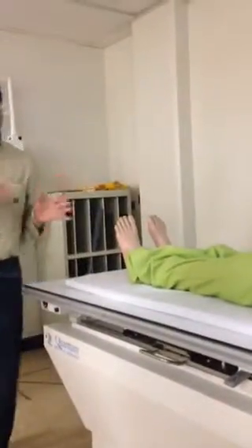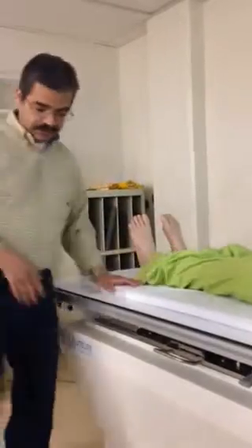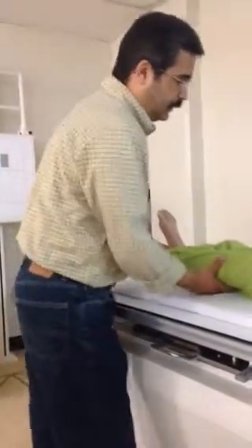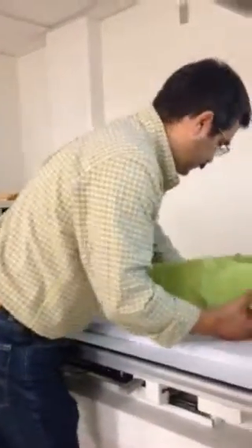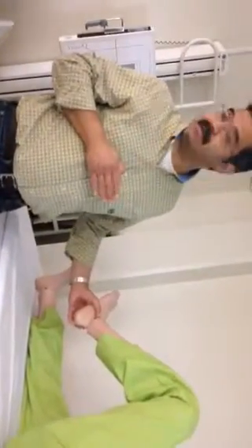So this is the time when we're going to use this projection. The idea is that we're going to bring this leg up, hands up, so we can see. The idea is to bring the leg up and take a picture. Our X-ray beam is going to come through and go through the neck of the affected side. Okay?